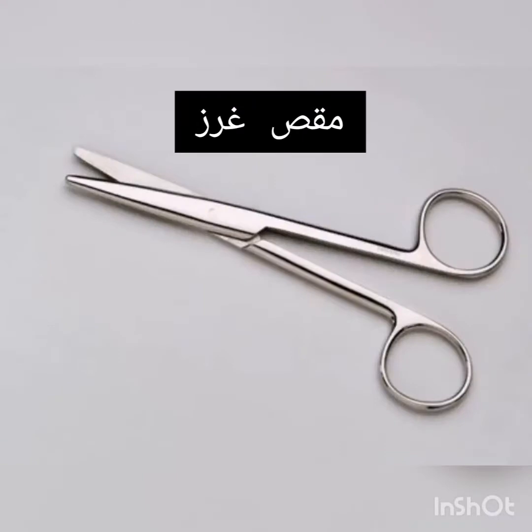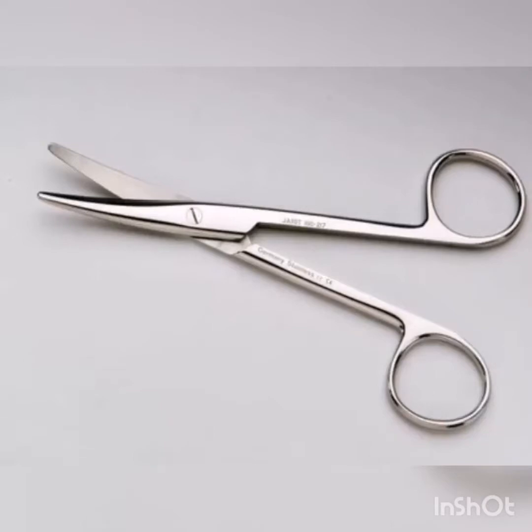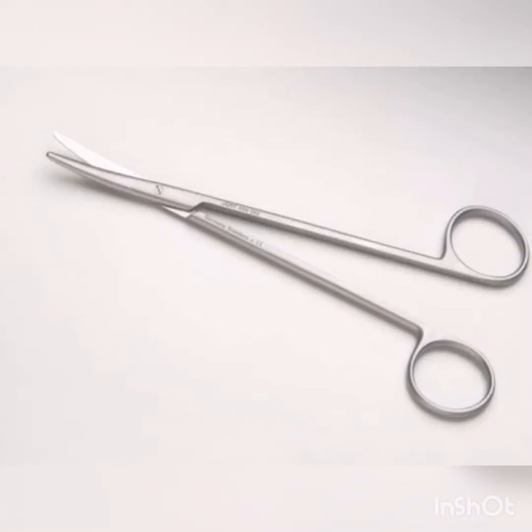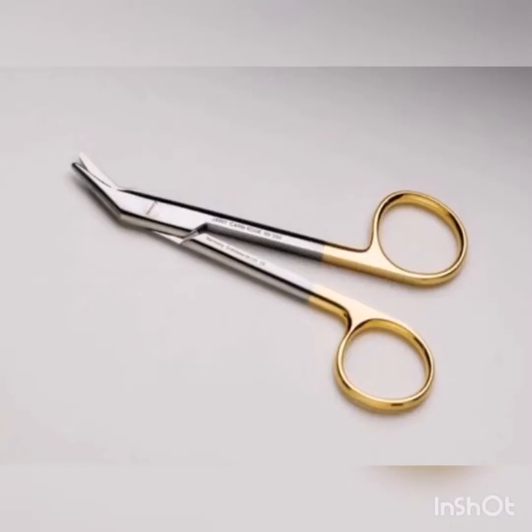Straight Mayo Scissors. Curved Mayo Scissors. Curved Metzenbaum Scissors. Lister Bandage Scissors. Wire Scissors.